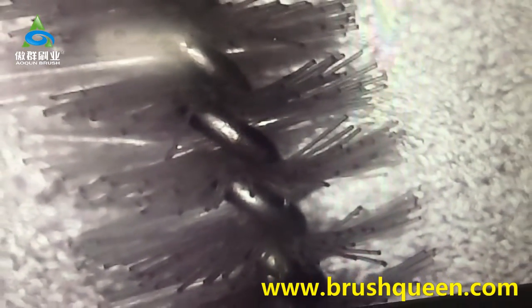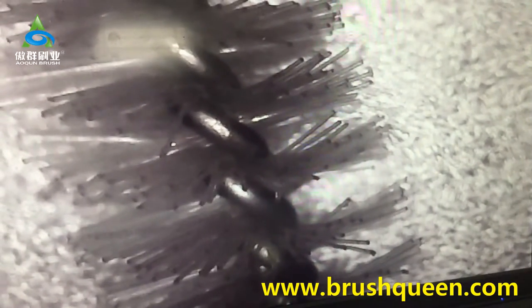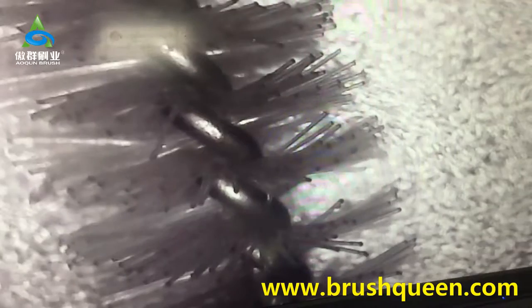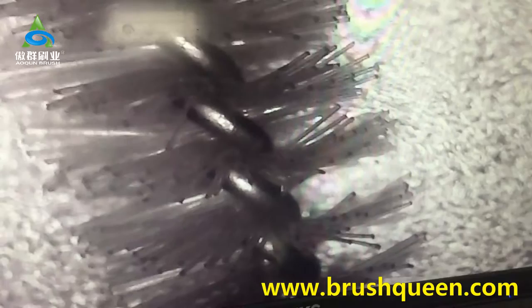If there is a burr, it is easy to attach dust and bacteria, affecting the cleaning effect. Now we use the Outrin Little Brush for testing.